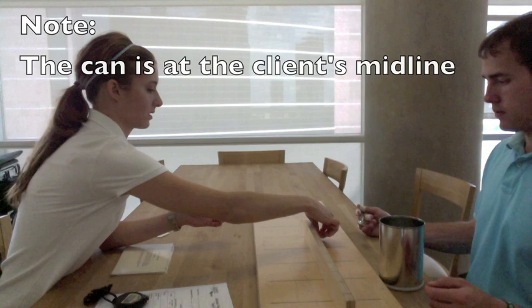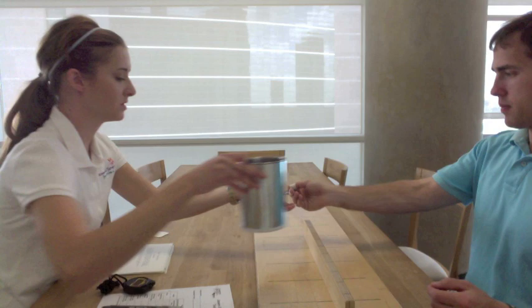'Now we'll do the same thing with your right hand, beginning here. Ready? Go.' After both hands complete the simulated feeding task, the therapist takes back the spoon.